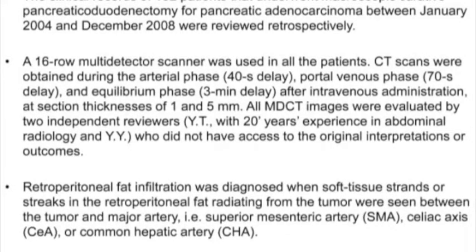Retroperitoneal fat infiltration was diagnosed when soft tissue strands or streaks in the retroperitoneal fat radiating from the tumor were seen between the tumor and major artery. We divided the degree of the retroperitoneal fat infiltration of the pancreatic cancer on MDCT into the following four grades.